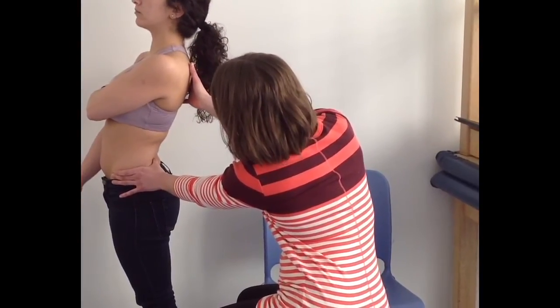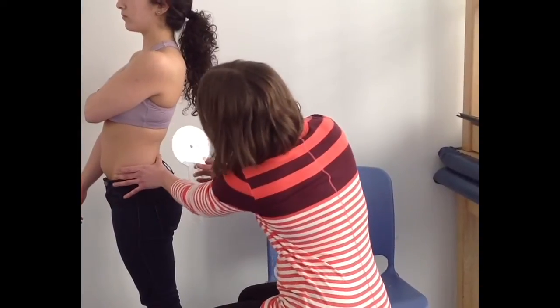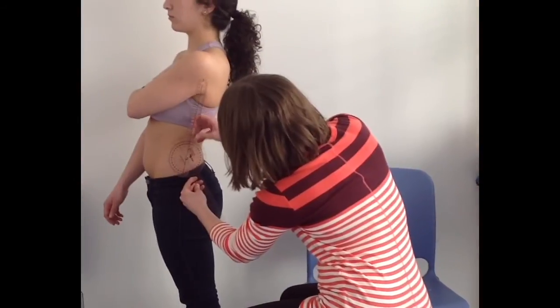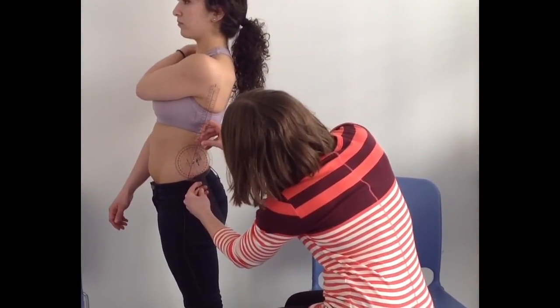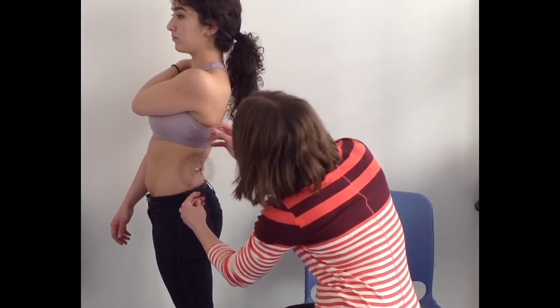I'm going to stop you right there because I felt your pelvis start to move. And if you could hold this position, I'm just going to measure the joint angle. Alright, and I'm getting about 30 degrees. You can go ahead and stand up.